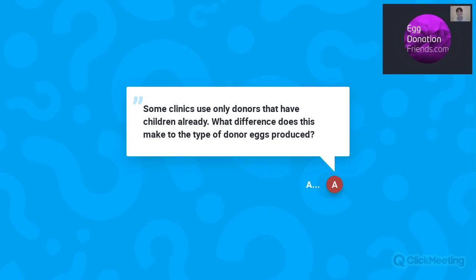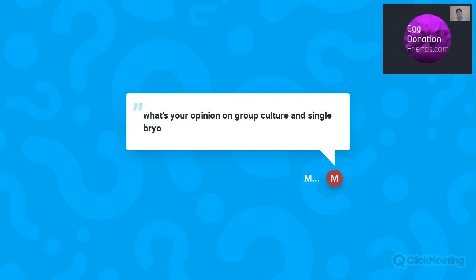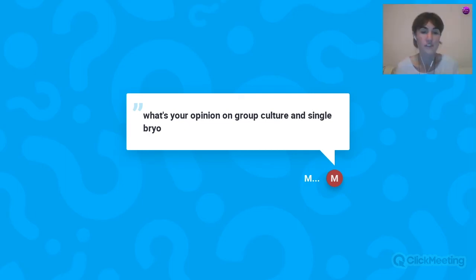The next question, which we will take a closer look, is this one. What's your opinion on group culture and single embryo? I think we already came across a very similar question to this. It might be an idea, but I think it's also related to, it depends on which dish you're using and how much media is on that dish.